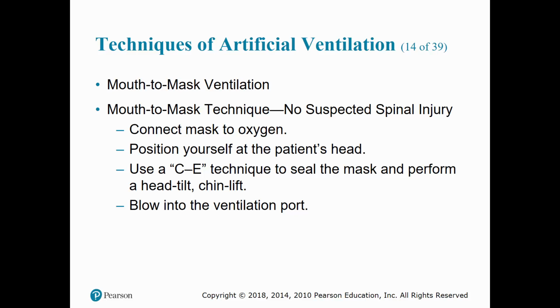You will then place your mouth around the one-way valve and blow into the ventilation port of the mask. Give a breath over a 1 second period. When the chest rises adequately, stop the ventilation to allow for exhalation.